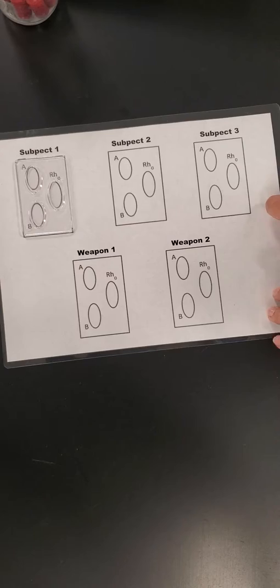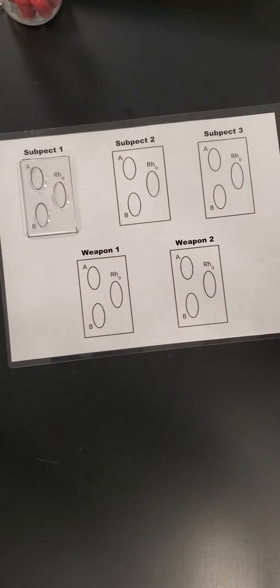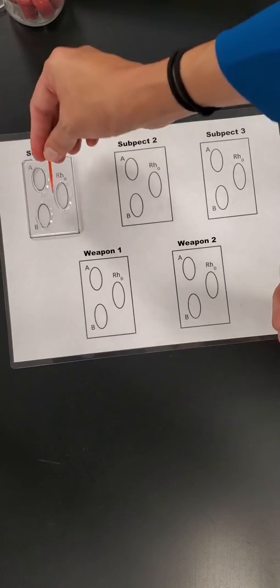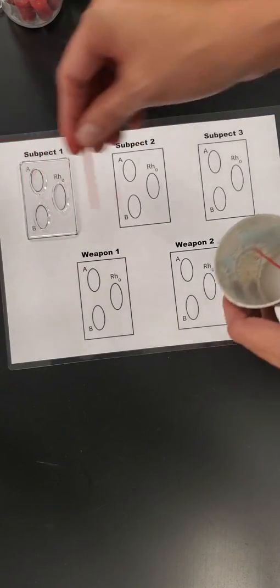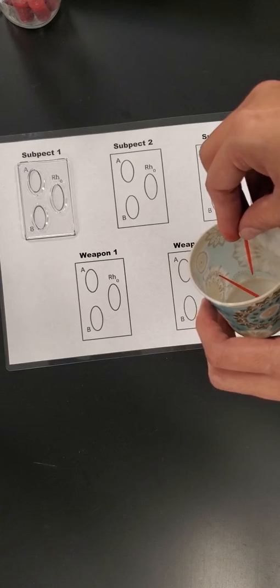The only thing that I do want to emphasize is I'm going to be providing a little toothpick for you to mix the serum with the blood to see if there's any agglutination. Before you move on to the next one, rinse it in the cup. I'm going to be putting some water in there, rinse it, and then mix the next one because I don't want any cross-contamination. So you should be rinsing quite often.